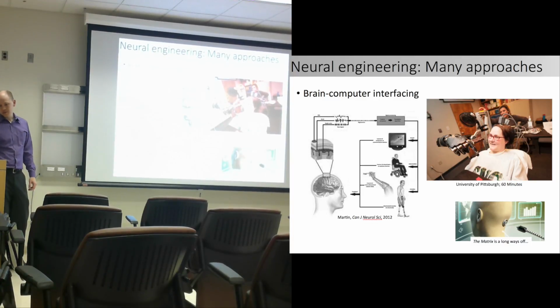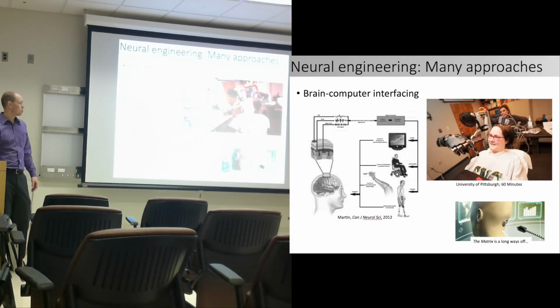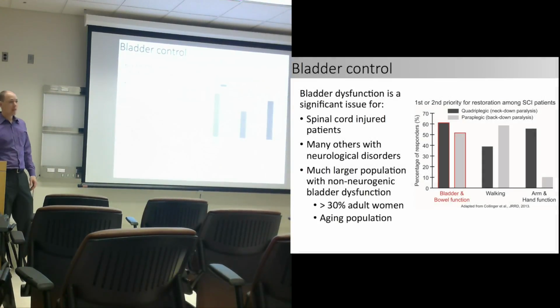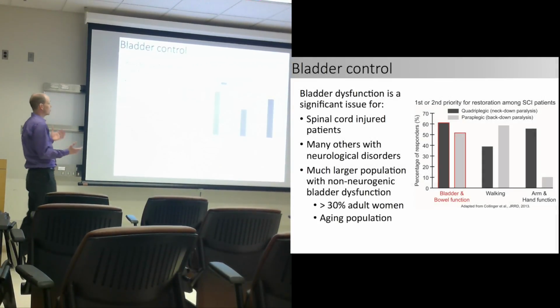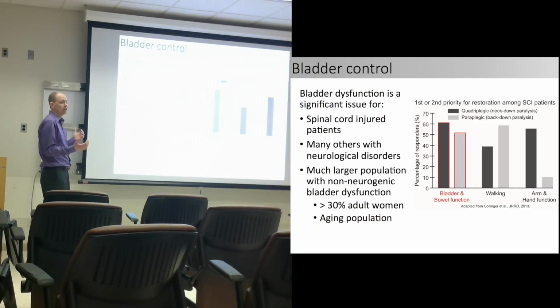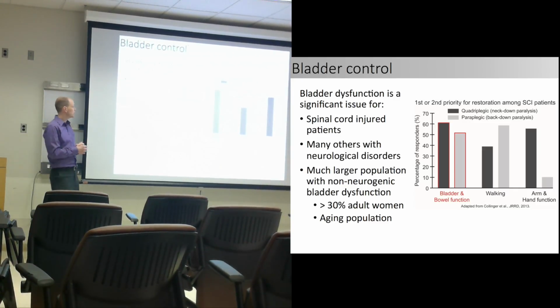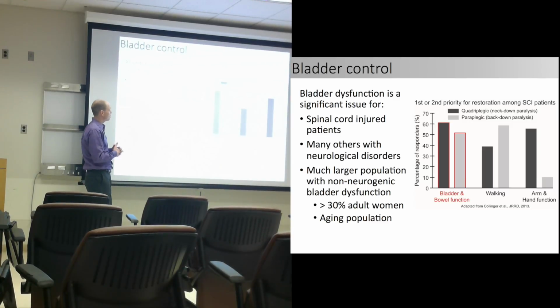So in my interest, what I'll talk about is more neural engineering for bladder control, for neuroprosthesis. Ultimately, part of my interest is that there's a huge need for it. So oftentimes we'll focus on spinal cord injury patients as typically needing help with bladder control.